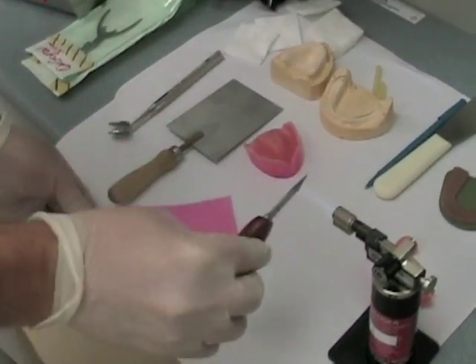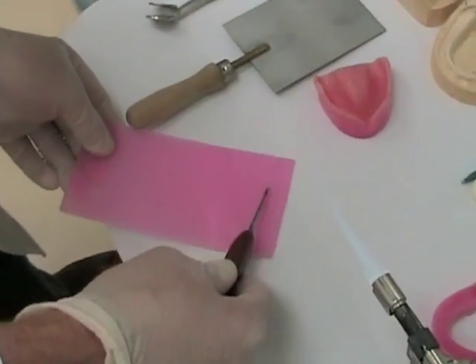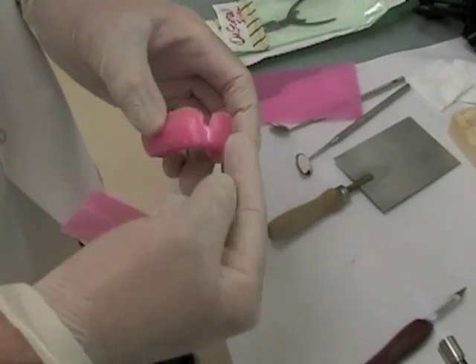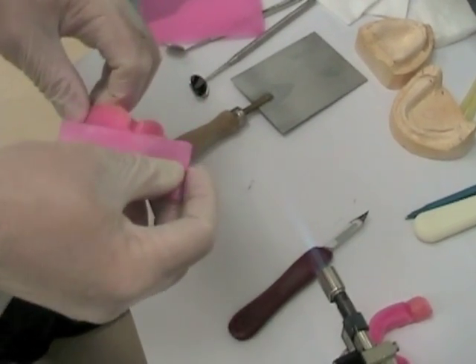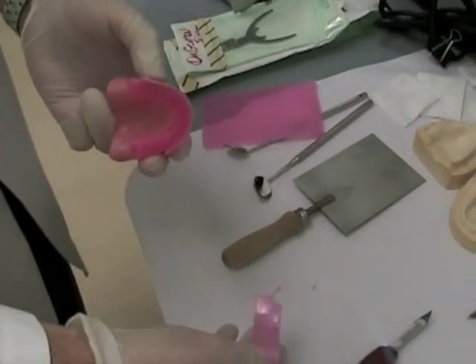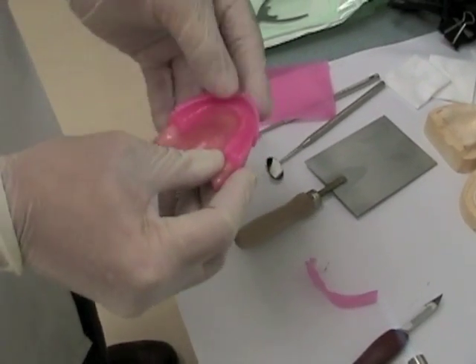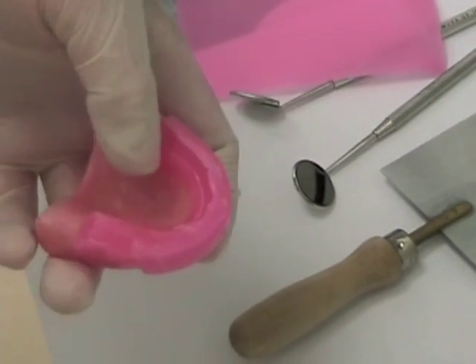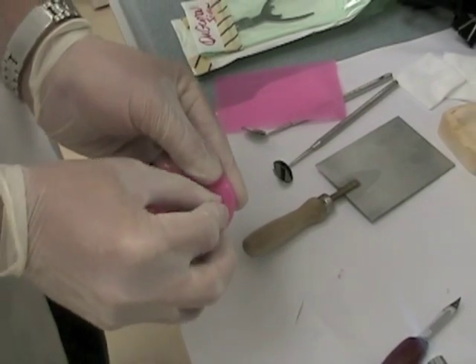Use a Bunsen burner or a butane torch to soften the baseplate wax you're going to add. It should be soft enough that it's drooping under its own weight. Heat your knife if you need to cut strips to add onto the surface. Addition of wax should be relatively quick — soften the wax on the existing rim and also the wax you're adding so they stick together. Avoid air pockets or spaces where the wax doesn't adhere, or it will fall apart when you adjust it. Here we've added to the facial surface and folded it over onto the occlusal surface, making sure it's well softened, then added more wax to the occlusal surface to increase the height and incisal display.